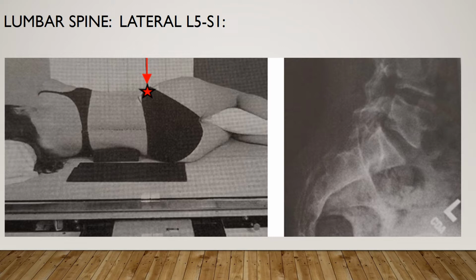The respiration is going to be suspended, and you're going to evaluate the image. You want to find an open L5S1, vertebral bodies, intervertebral joints, and foramina and spinous processes. Intervertebral joint spaces and intervertebral foramina are open with no rotation. Optimal density and contrast with no motion. Soft tissue margins are visible and bony detail of vertebral bodies, joint spaces, and spinous processes.